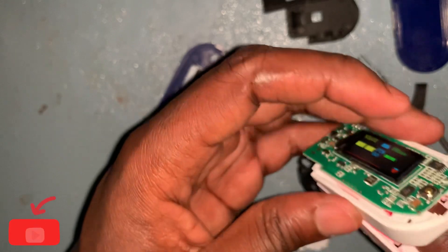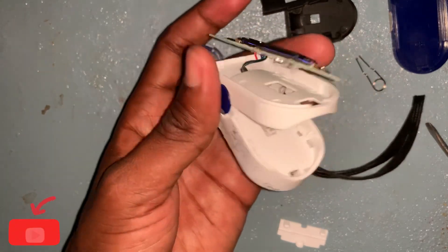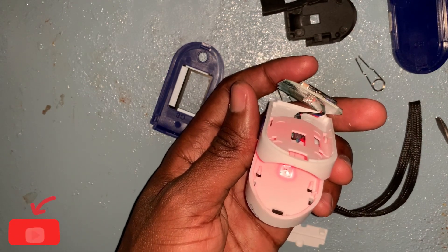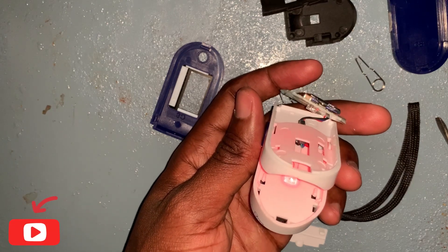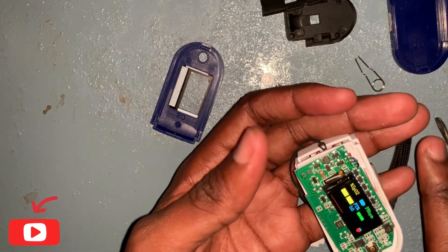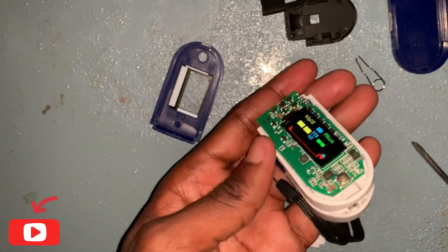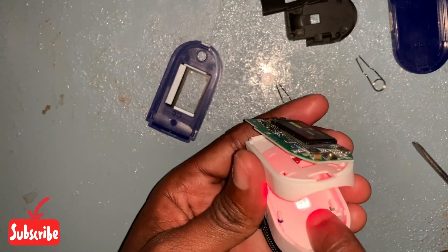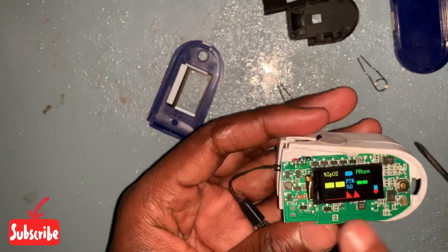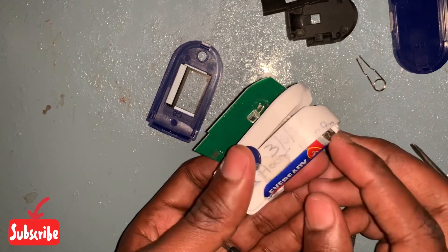The principle of pulse oximetry is that oxygenated blood absorbs infrared light while deoxygenated blood absorbs red light. The sensor calculates the absorbed light and the scattered light, then projects it onto the screen. The LED light, the sensor, the battery pack, the monitor, the circuit board, and the switch are all the main components of this device.